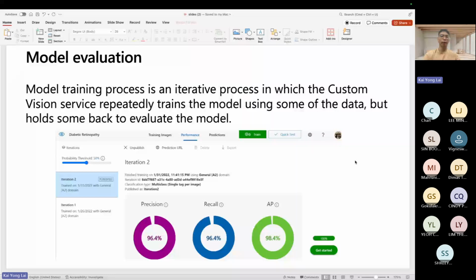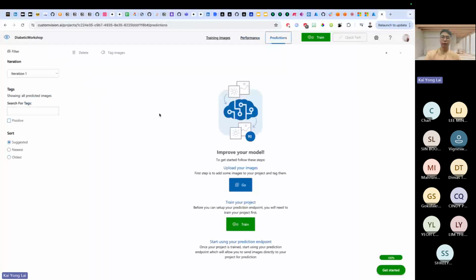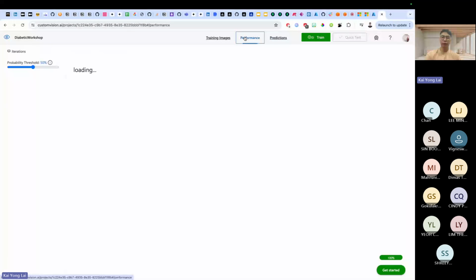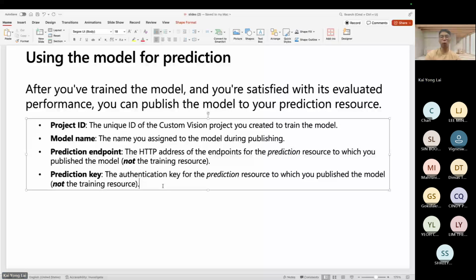So once this model evaluation is done, we actually need to publish our models. And we can also test the predictions. You can see these prediction tabs, right? This is where you can test your models. I think as of now it's still running because we have quite a lot of data. Okay. And then these are important things that we need to integrate with Power Apps later.